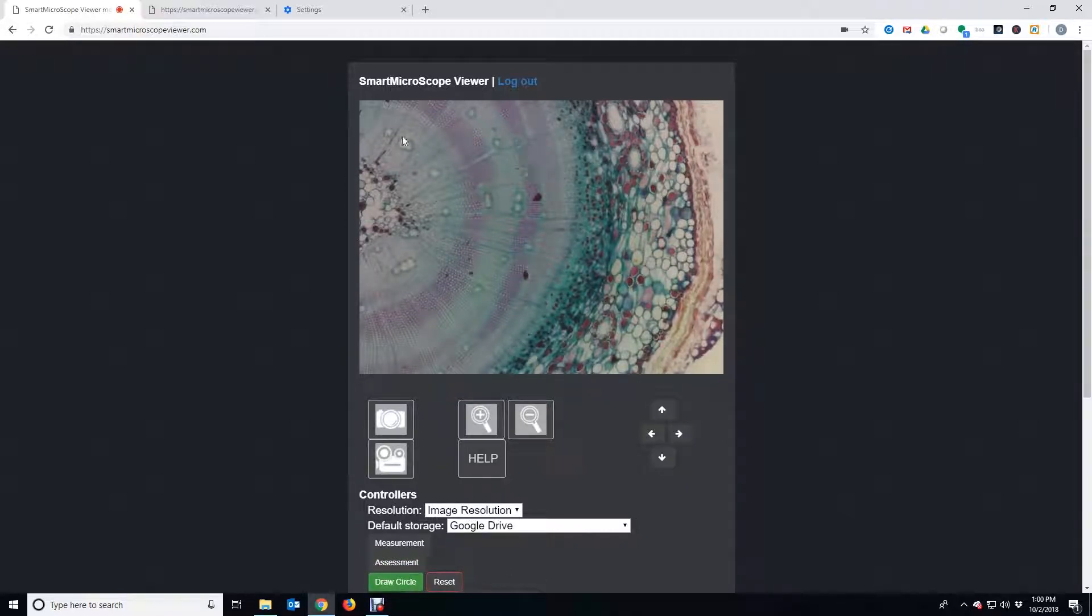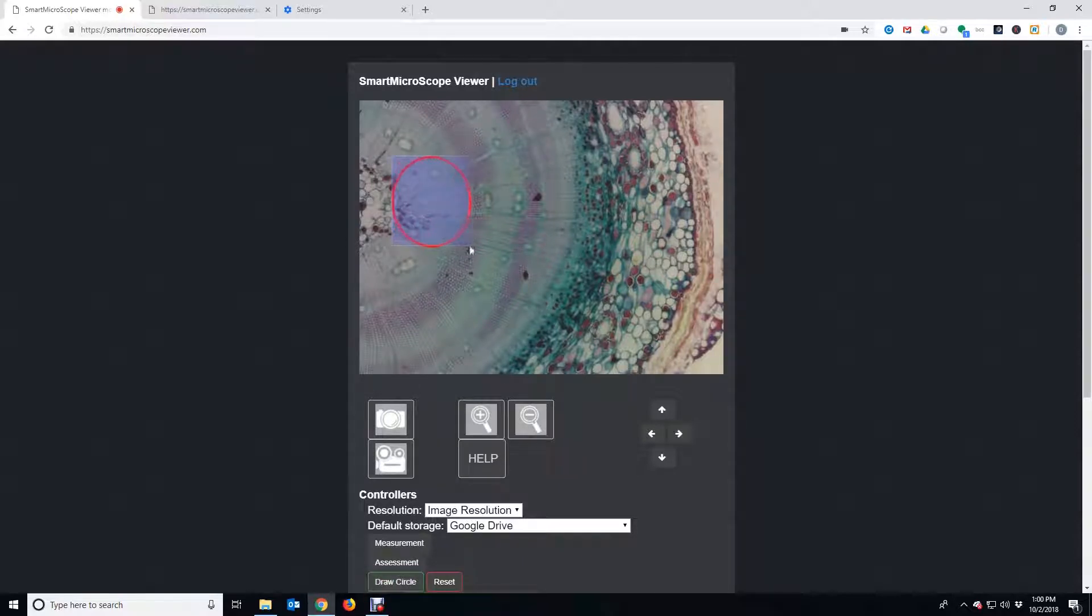Another popular feature is the option to draw a circle to point out specific areas of the image.